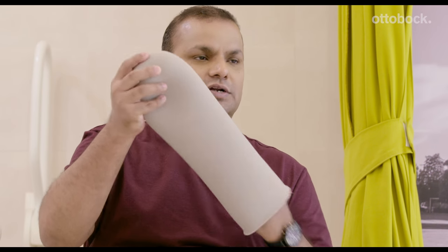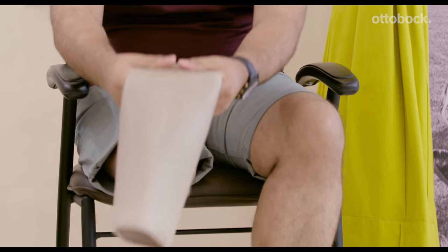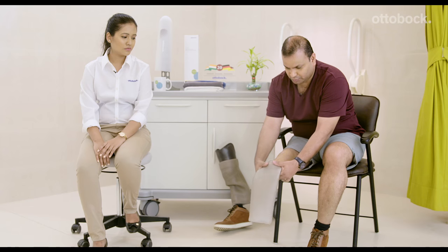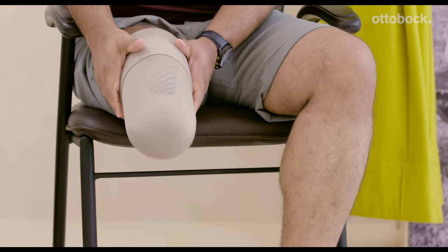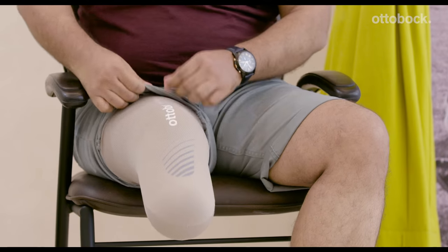To wear your below-knee prosthesis with one-way valve, you will have to do two things. First, donning your liner. To wear your liner, first turn it inside out. Place the base of the liner at the distal end of your residual limb, taking care not to trap any air between your liner and your skin. Then gently proceed to roll up your liner on your residual limb, all the way up till it is the right side out.